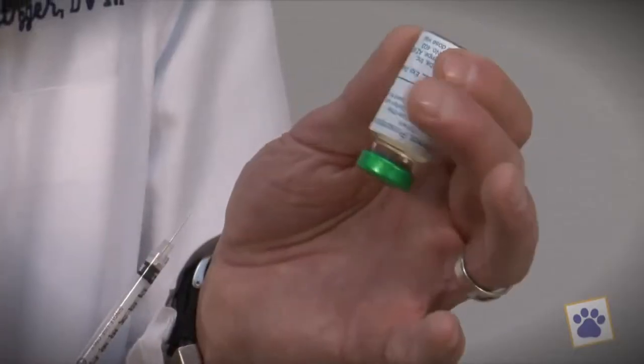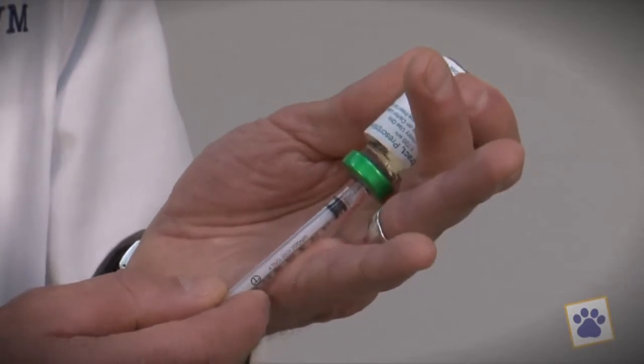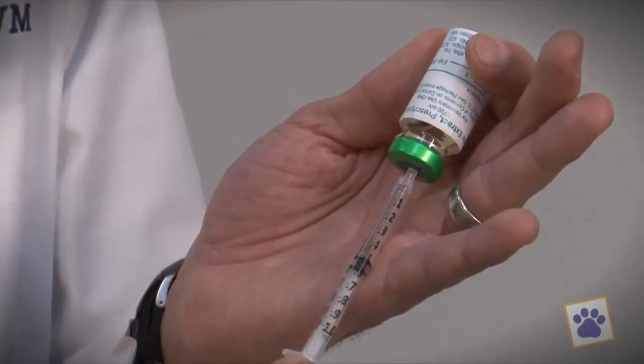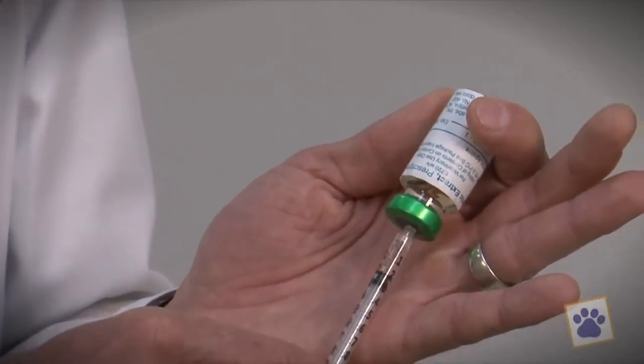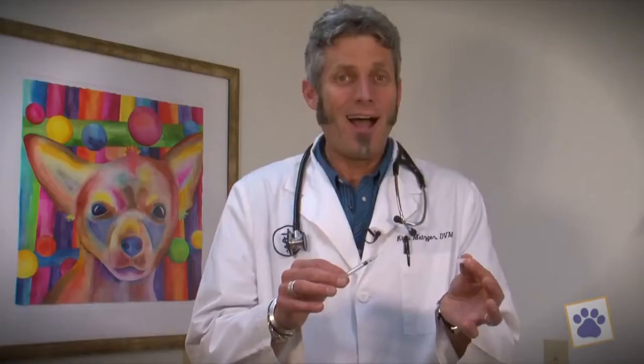I've taken the allergy serum out of the refrigerator. To draw the serum from the bottle, we're going to invert the bottle. I'm going to remove the scabbard from the needle. With the vial inverted, I'm going to stick the needle through the center of the rubber stopper. Since this is early in this dog's series of shots, we're only giving 0.2 ml. Notice that I've gone well below 0.2, and now I'm going to push the stopper back up to 0.2 — that removed any air bubbles from the syringe. I never place the scabbard back on the needle; it's an easy way to poke yourself instead of the dog.